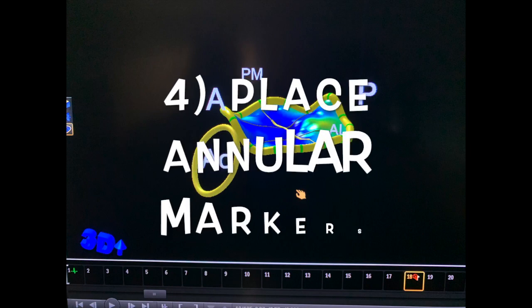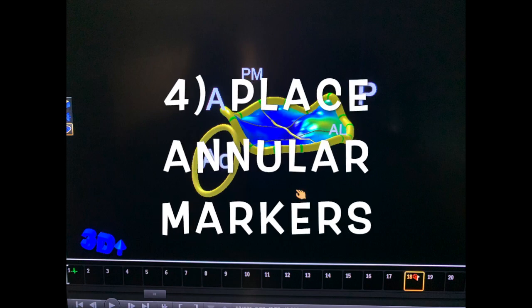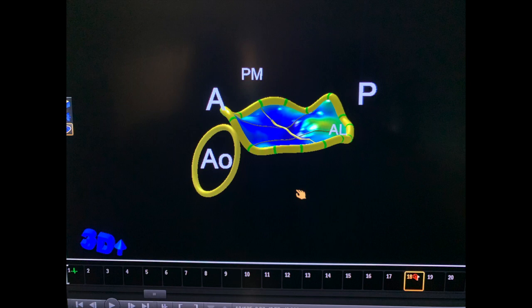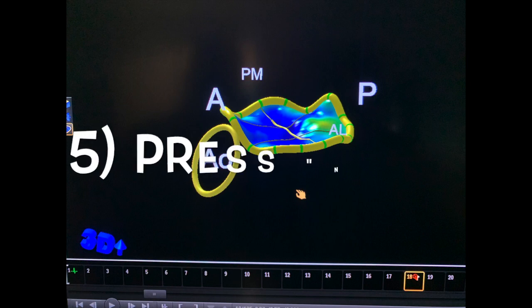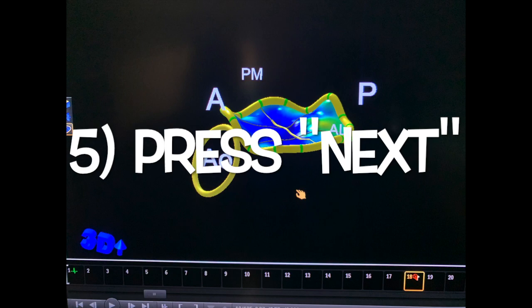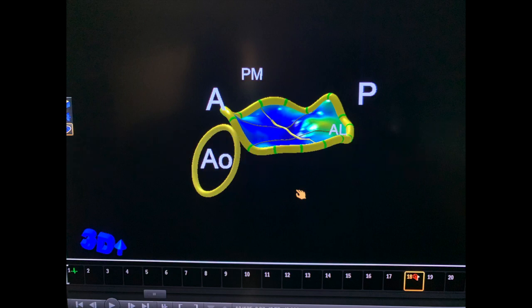Number four, place the annular markers as instructed by the software. And number five, just press Next, and everything is processed.